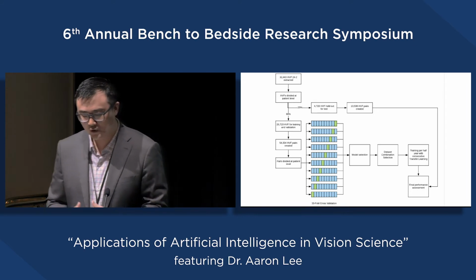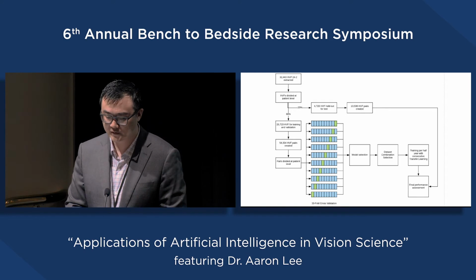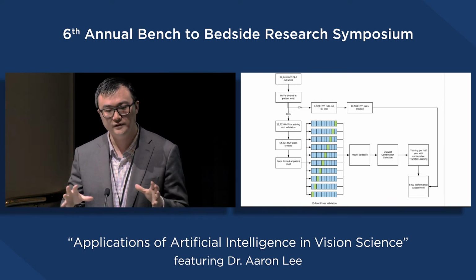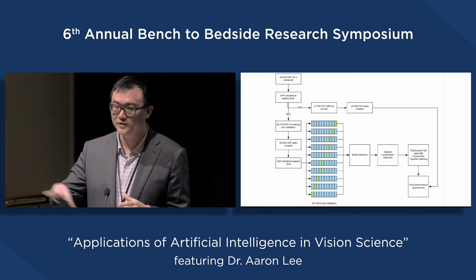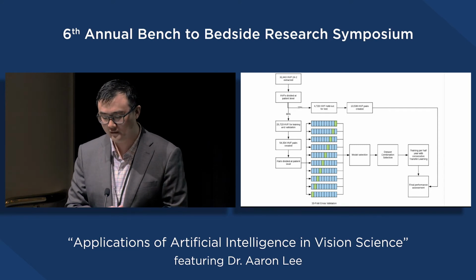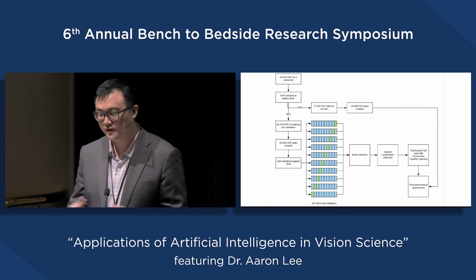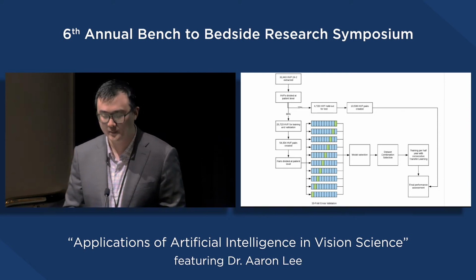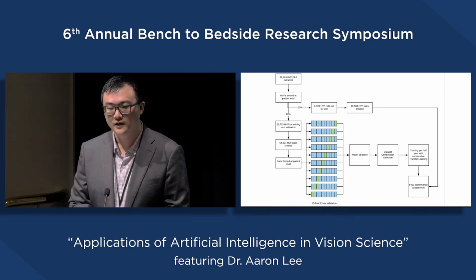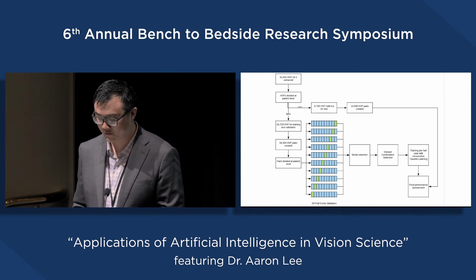And so we're worried about overfitting and all these different kinds of machine learning problems. So we took a very stringent approach where we immediately divided the visual fields at the patient level, and 20% we reserved for testing. So we only tested it once at the very end. The other 80% we did tenfold cross-validation, and we did model selection, and we picked hyperparameters and built the models. And at the very end, we tested on that test set once. And so all the things I'm going to show you after this slide are from that test set. So the model had never seen it before.